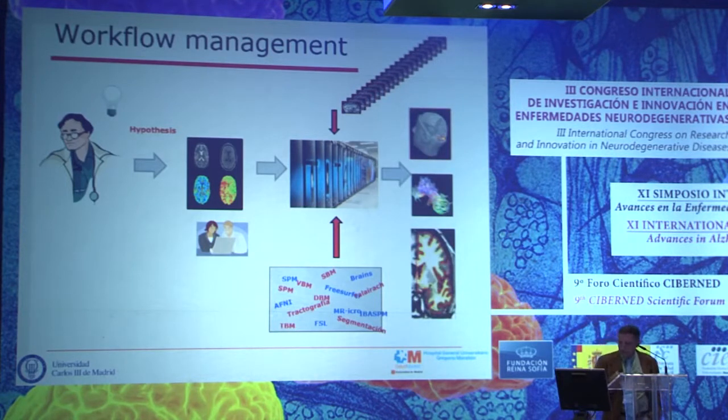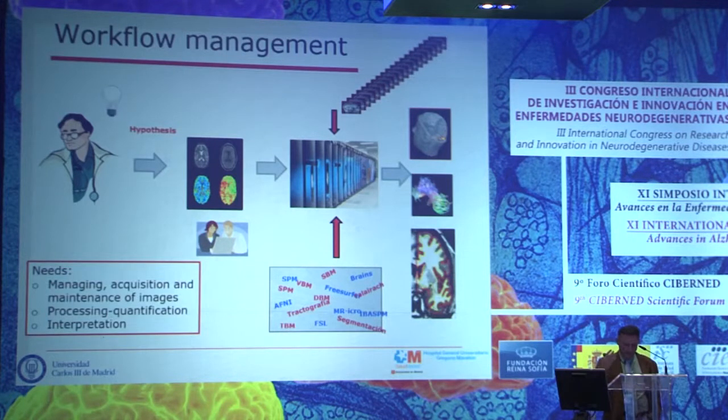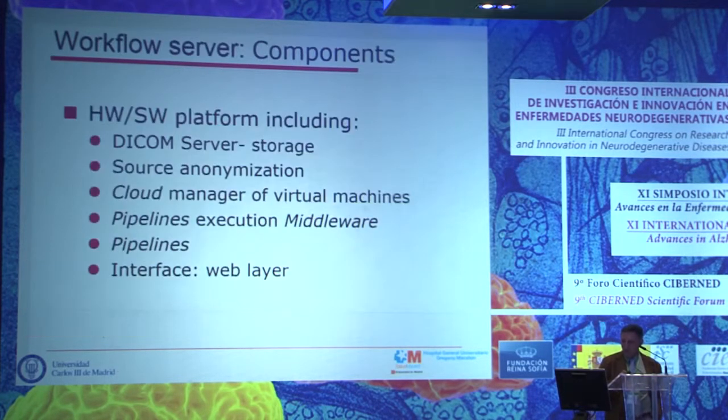So the whole process has several needs for the user, so to speak: how to manage, how to acquire, how to maintain those images, which is the proper processing and quantification that has to be used, and how to interpret those results. So in our opinion, this is a process which can be much better fulfilled with multidisciplinary collaboration.